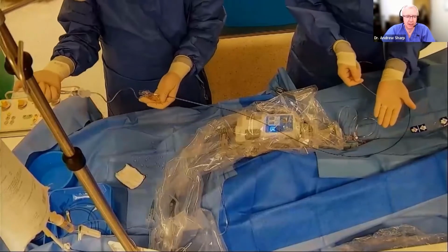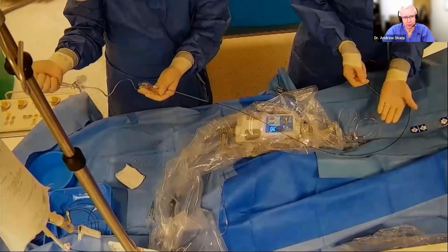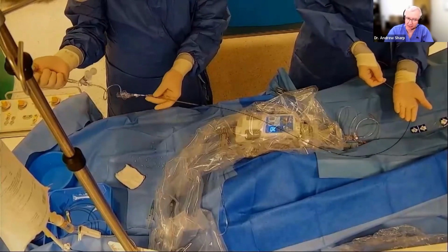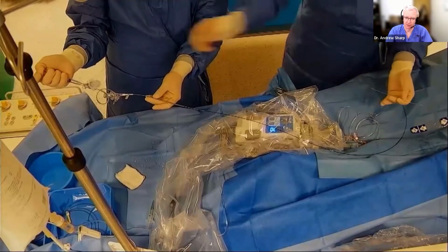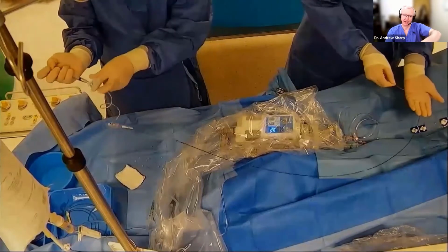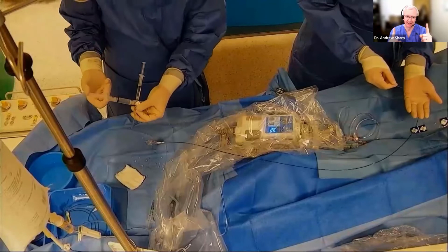My assistant here, who is Dan, one of our excellent scrub nurses, starts flushing through, and I can see that there's resistance, and I realize why. The reason is that the catheter sheath is forwards, and what you want to do when you're prepping is to have the IVUS back within the sheath, so that there's about that much length outside of the sheath.